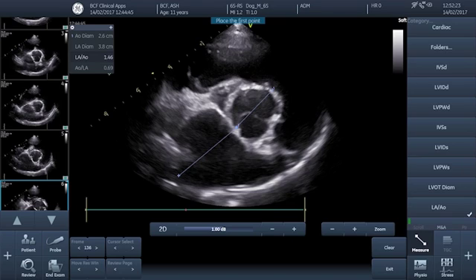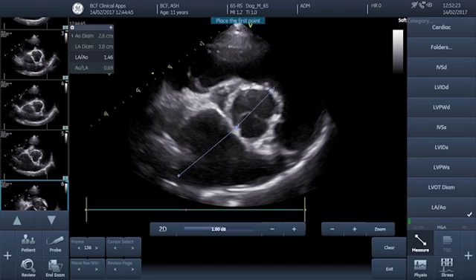As with all measurements in veterinary practice, a single standalone measurement is not terribly accurate or reliable. It's now advised that you repeat these measurements over five cardiac cycles — five different measurements in five different cardiac cycles — and then take an average. If you have any clearly erroneous or aberrant results that are nothing like the remaining four, it's worth taking a sixth or seventh measurement and then averaging only the values that are similar to one another, rather than including a clearly erroneous result.